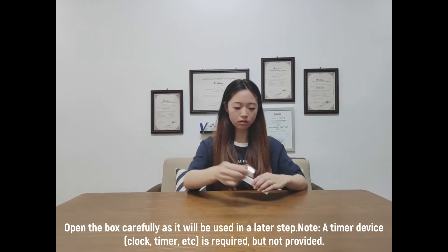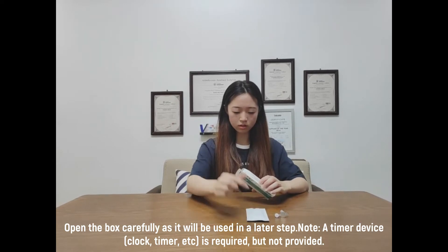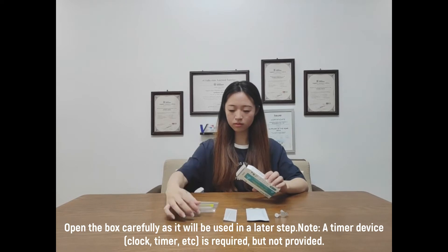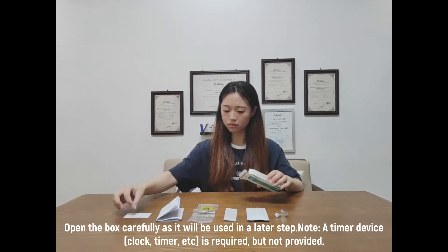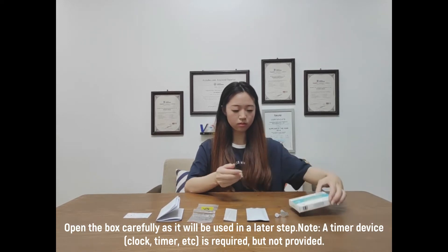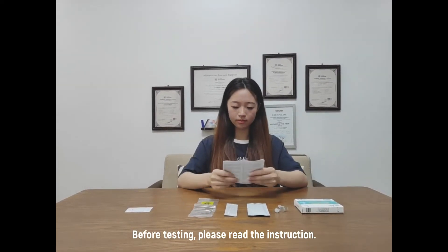A timing device — clock, timer, etc. — is required but not provided. Before testing, please read the instructions.